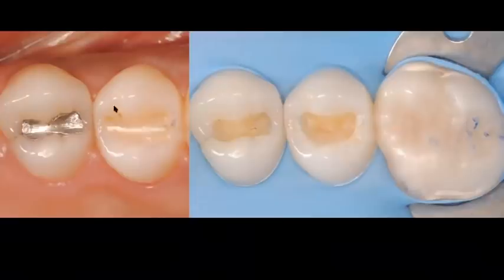We went ahead and we removed both restorations. And I want you to pay attention to this composite right here on the second premolar, because this is what I normally see when I get patients that come to me and require either other treatments or for me to just go ahead and restore an occlusal or a restoration on a posterior tooth. So the idea that I want to share with you here is that we all learn in dental school the horizontal layering technique to restore posterior teeth. And one of the things that I do not like about this technique is that you always end up having these flat restorations. They really don't have any anatomy.